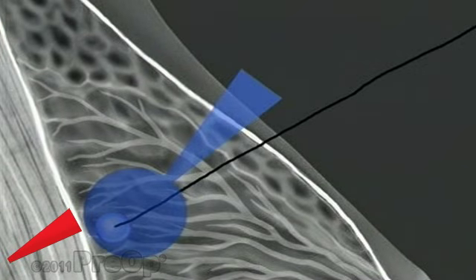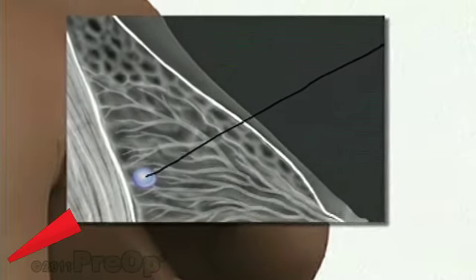Once the incision has been made, your doctor will begin cutting along the wire, moving towards the abnormality located at the end. You will feel some tugging and pulling, but you should not feel any sharp pain. If you do, please tell the doctor and you will be given more anesthetic.